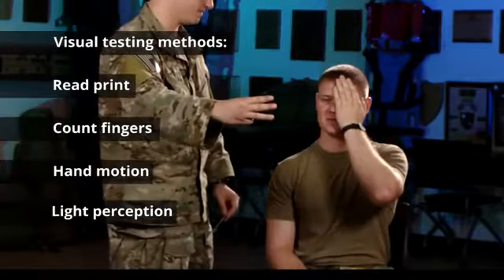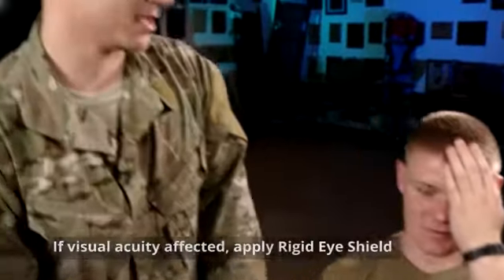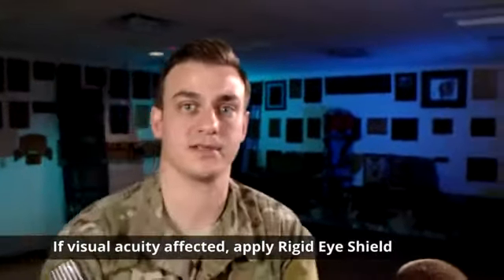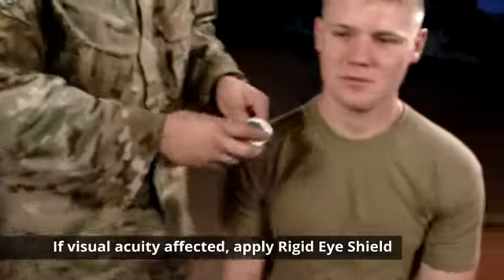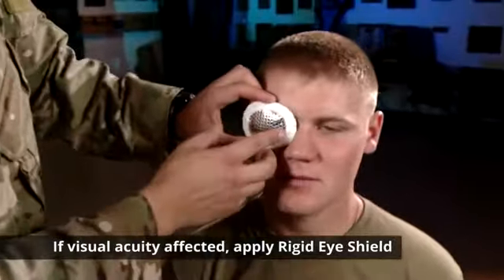How many fingers am I holding up? I can't see it. After determining that the casualty's visual acuity is affected, we are going to apply a rigid eye shield.